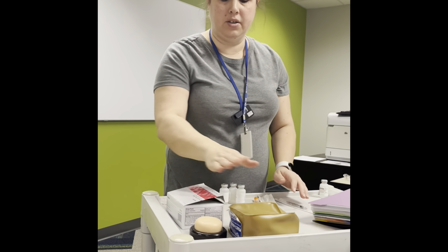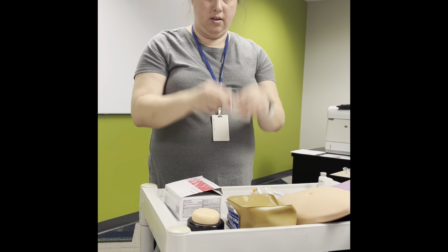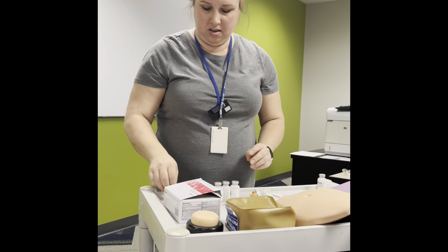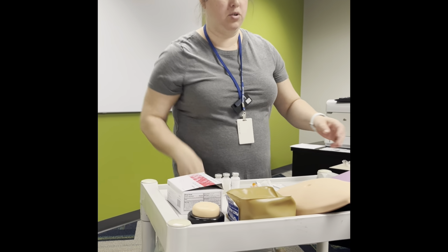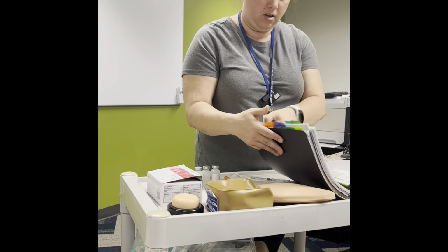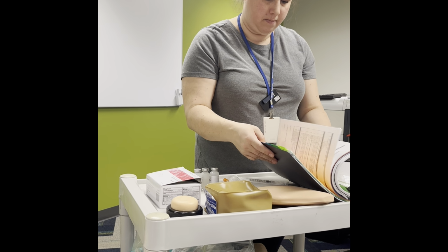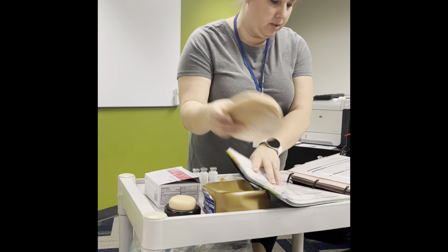You have the 3 needles, 3 pads, 3 meds, some alcohol wipes. I'm just trying to get rid of as much stuff in front of me as possible. Okay, I'm gonna open up. All right, so we'll have this.